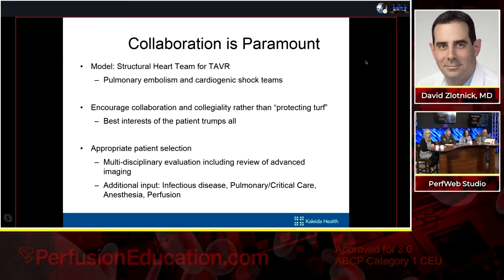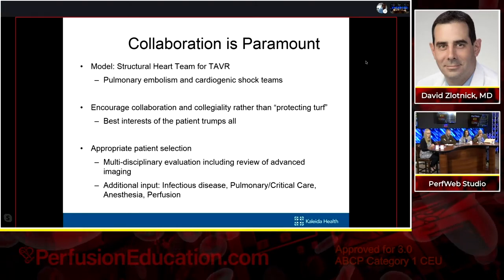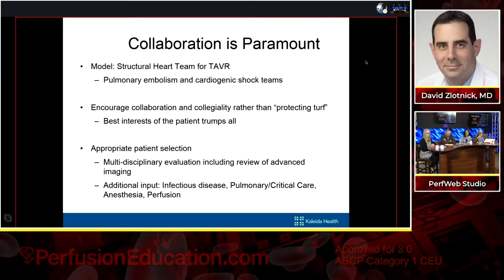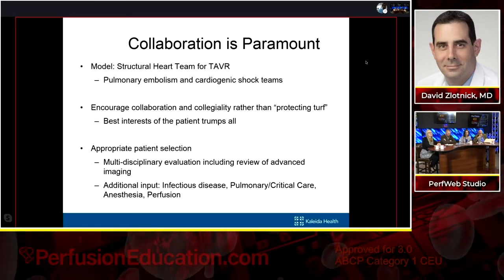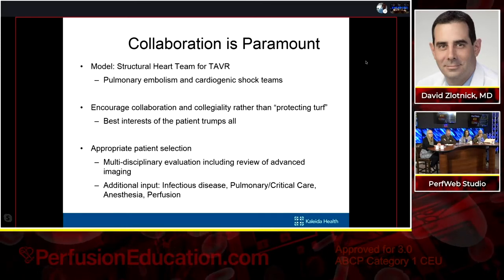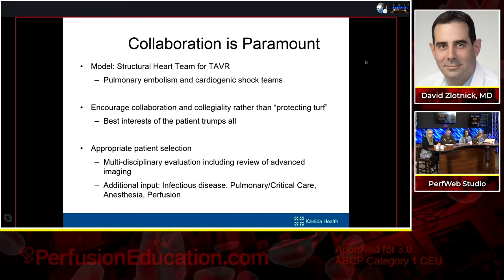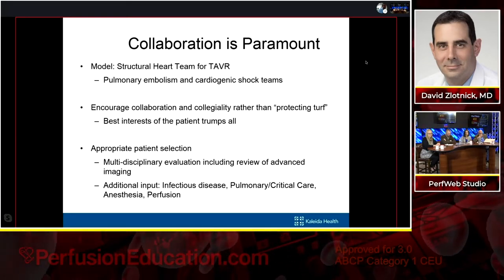And then obviously we want to have appropriate patient selection. When I got in, Mark was talking about the five things that he thinks about when he is recommending AngioVac. Really, we want to have a multidisciplinary evaluation and review all the imaging and understand, is this the right patient that we should be thinking about AngioVac for? And get additional input from our infectious disease colleagues, our pulmonary critical care colleagues, anesthesiologists, and perfusion.